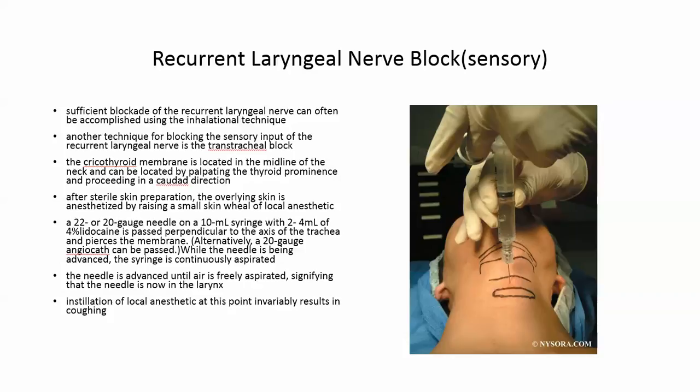The needle is advanced until air is freely aspirated, signifying that the needle is now in the larynx. The local anesthetic is instilled, which results in coughing.